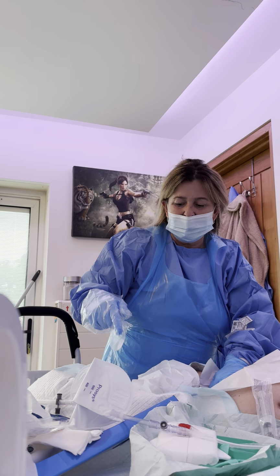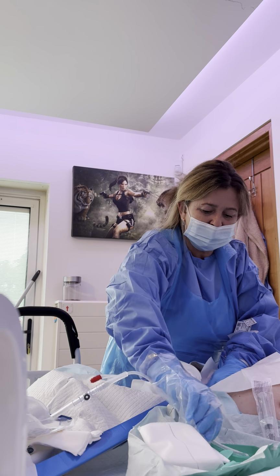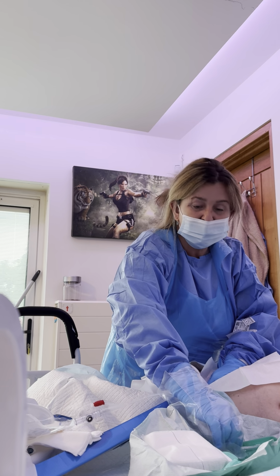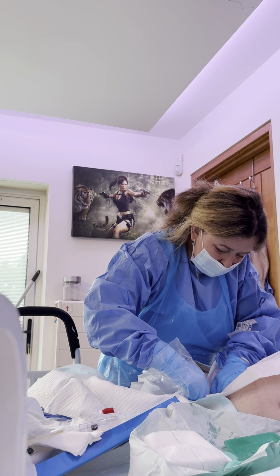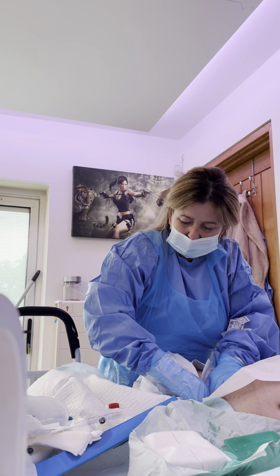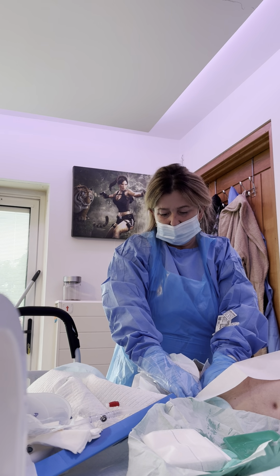I've already reconnected the new bag. And this is obviously the new catheter. And I'm going to put all the instillagel in there, which numbs it. So, ready, baby? Take a breath. 1, 2, yeah, in. Okay. So I'm messing about with it just so. There you go. So I'm going to get that blood that you can see.